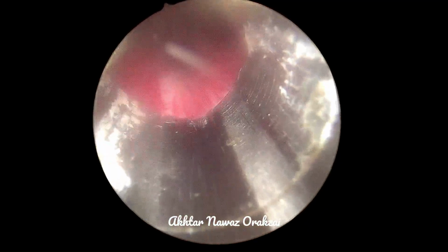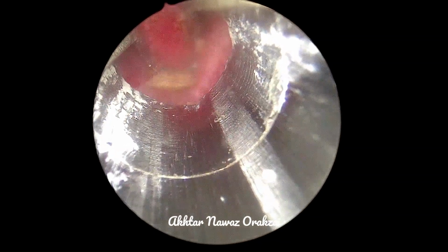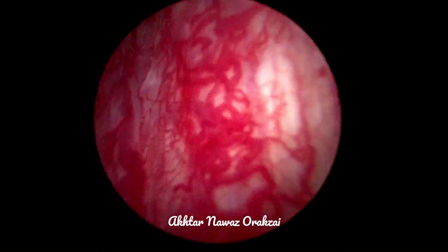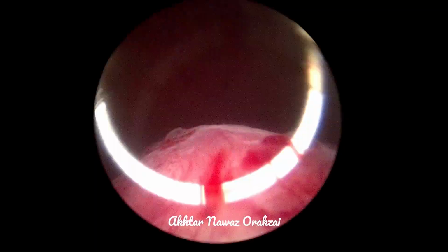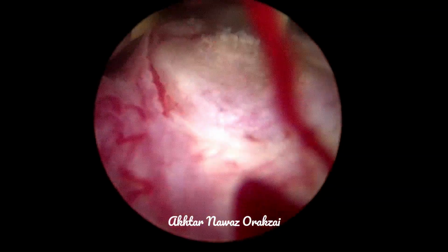Once we are sure that there are no big pieces, the small pieces can be retrieved using the Ellik evacuator as well. So instead of causing more bleeding, we decided to switch to the resectoscope and start resecting the median lobe.